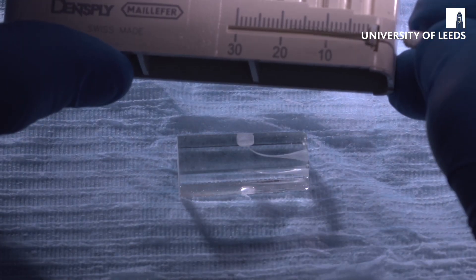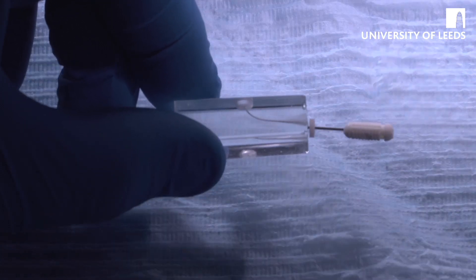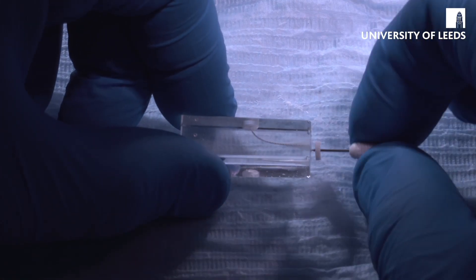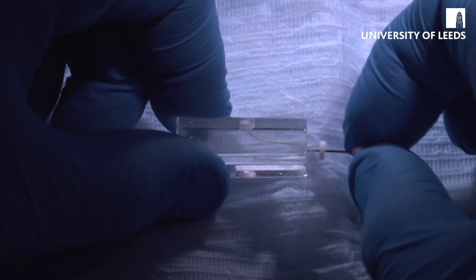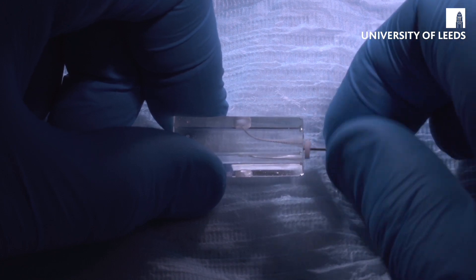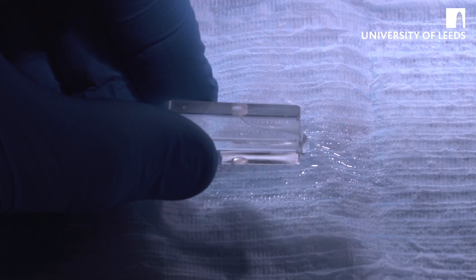Measure the size 15 and insert it. Just to check we've got the right amount of coronal flare — if it goes to length just by tapping, without having to work or screw it in, that's absolutely fine. Now we're going to work that to create our apical glide path, working it until it smoothly and easily goes into the apex. File out, irrigate again, then patency file to remove the debris.